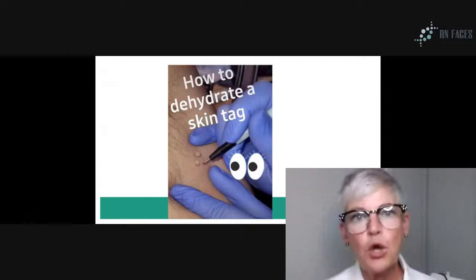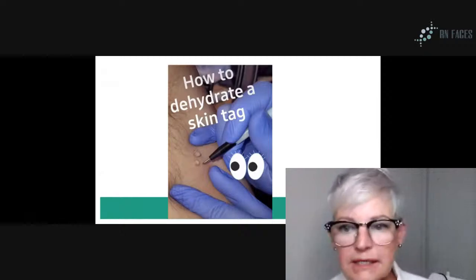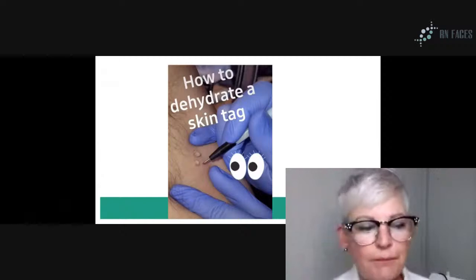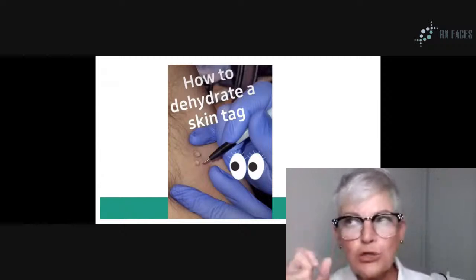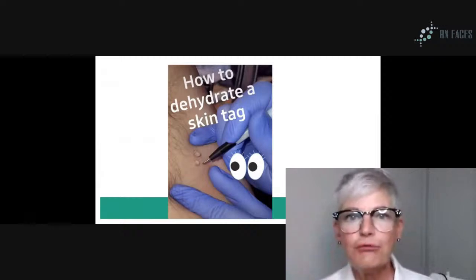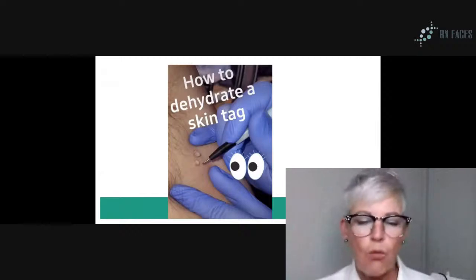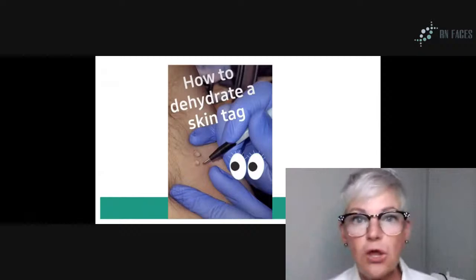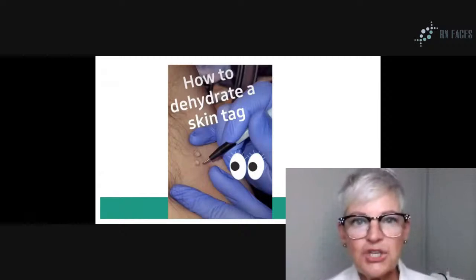Where a lot of people get into trouble is they may see a big skin tag like that, and they might do something like tap, tap, tap, tap, tap, and that's too light of a connection. You need to really get the current in here to dehydrate. Once you just see it blanch a little bit, doesn't mean you're done. So these larger ones call for more time, more hang time on that initial touch.